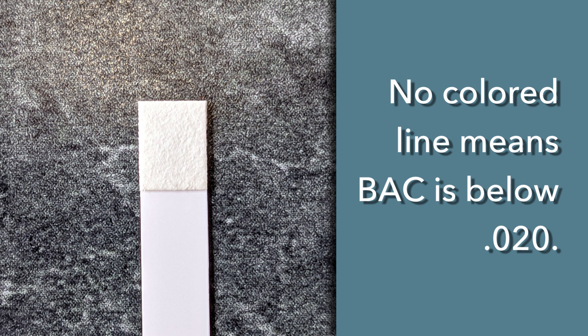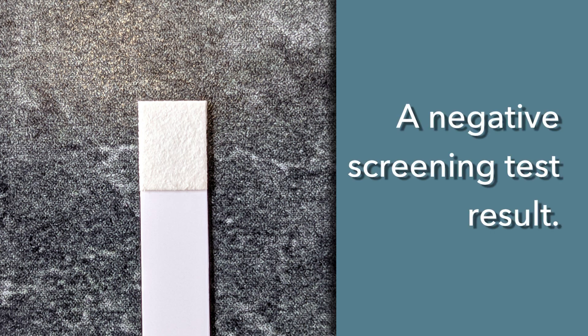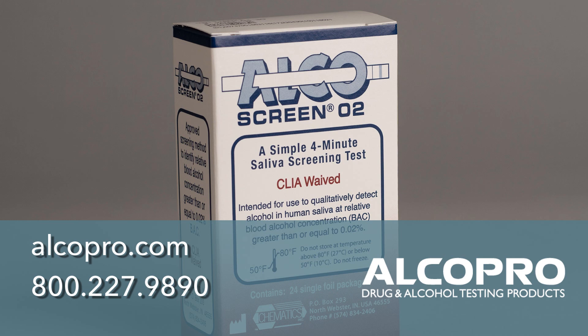If no colored line appears on the test pad, the BAC is below .020 and the test, by DOT standards, is considered to be a negative screening test result. The AlcoScreen O2 is in stock and ready to ship. Order yours today.